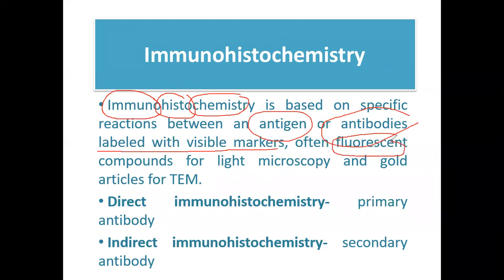Maalala nyo kanina guys, dun sa direct fluorescence assay, di ba? Yung fluorochromes natin, binigyan ko kayo ng example. We have your fluorescein isothiocyanate, your auramine, your rhodamine. So these are examples of markers that we use. But you have to take note na hindi lang fluorochromes yung ginagamit natin, guys, na label for our antibodies. We may use particles like latex.